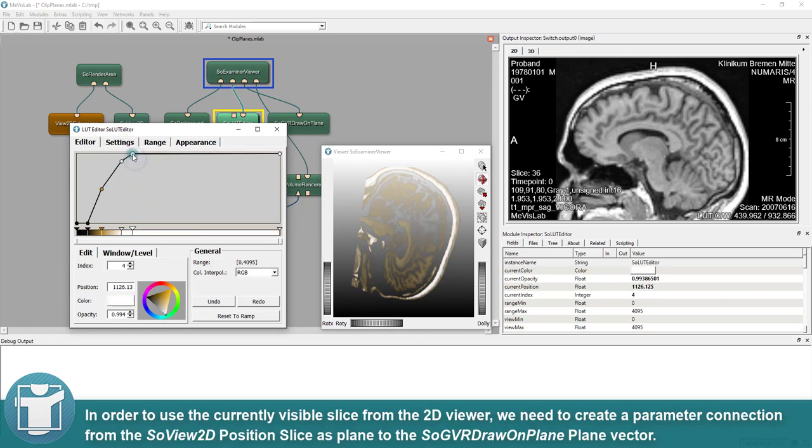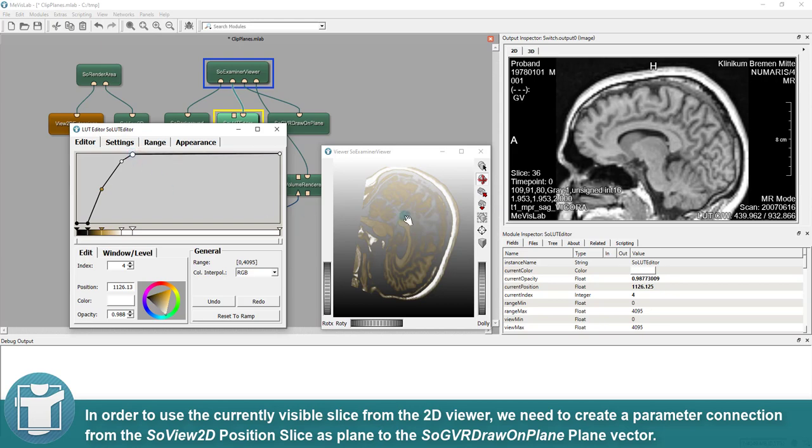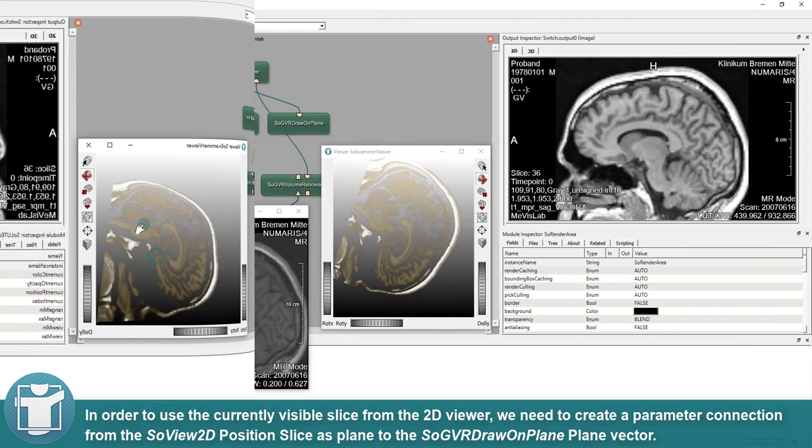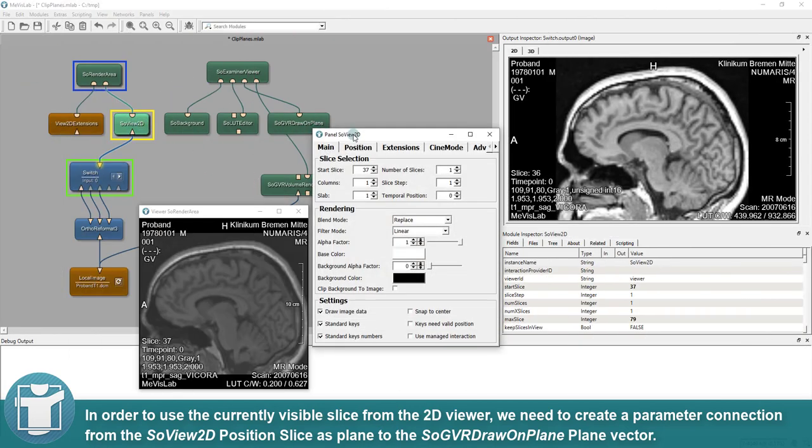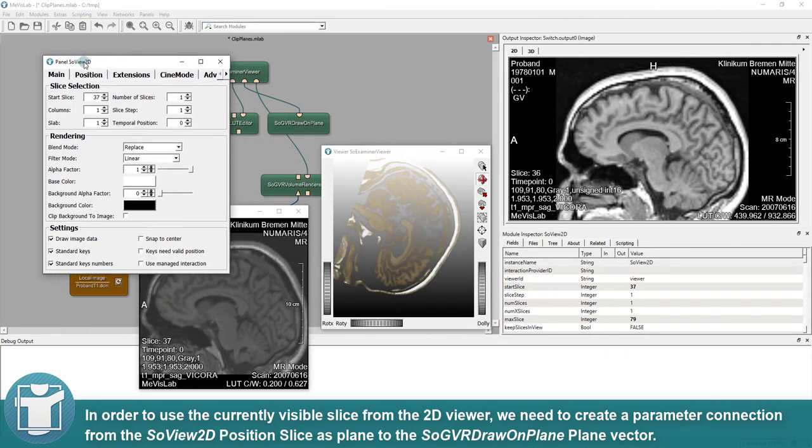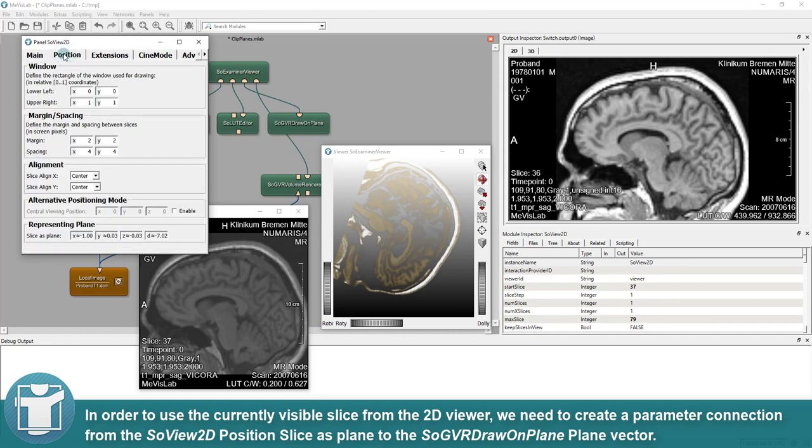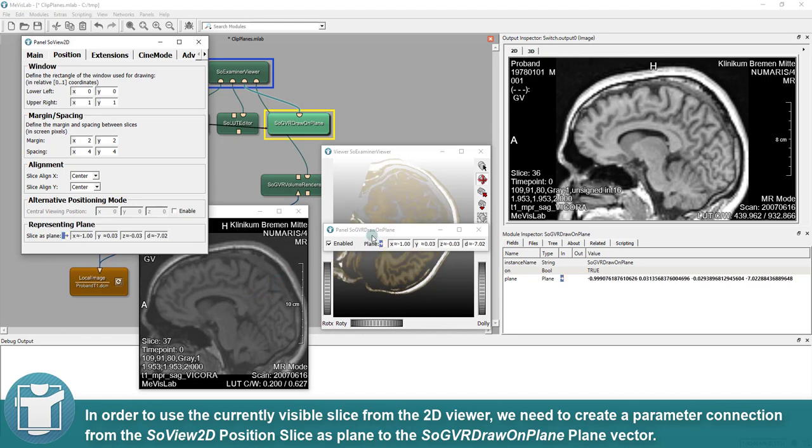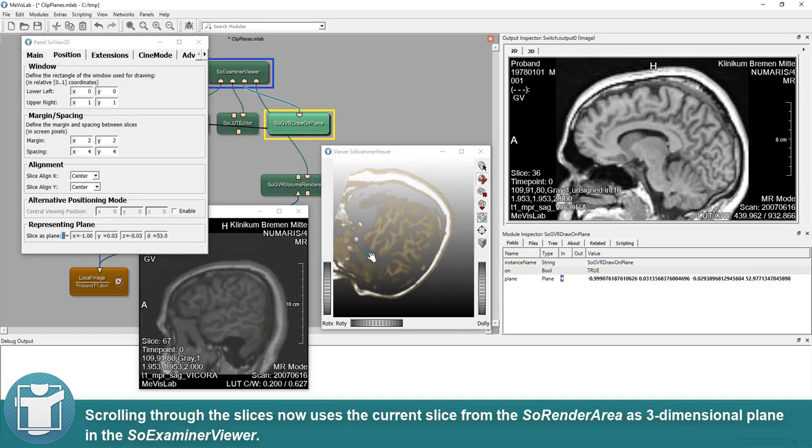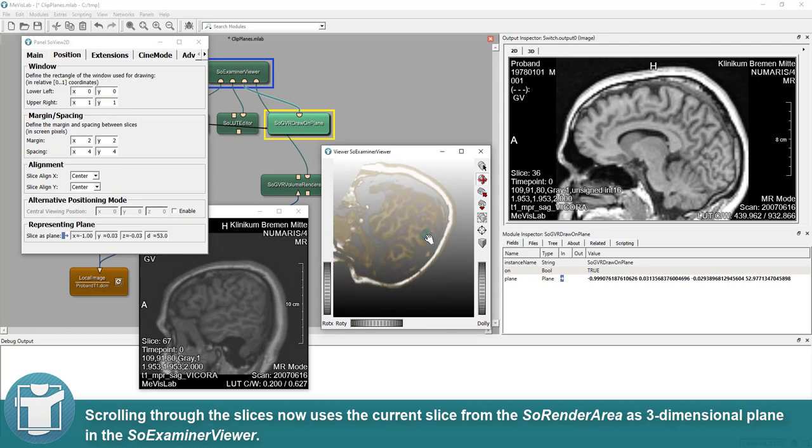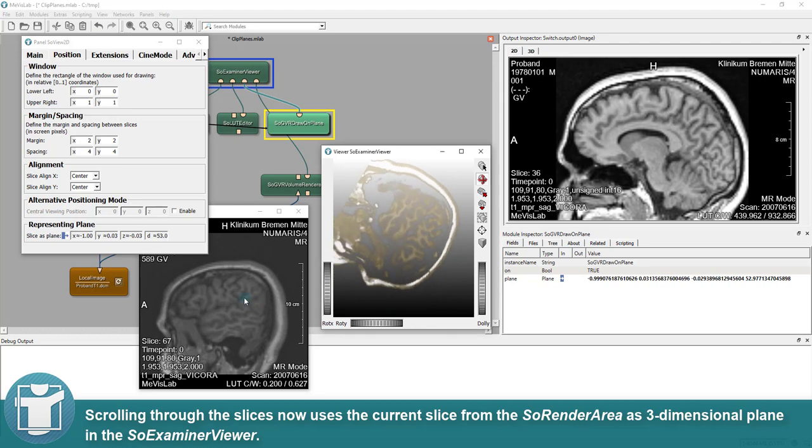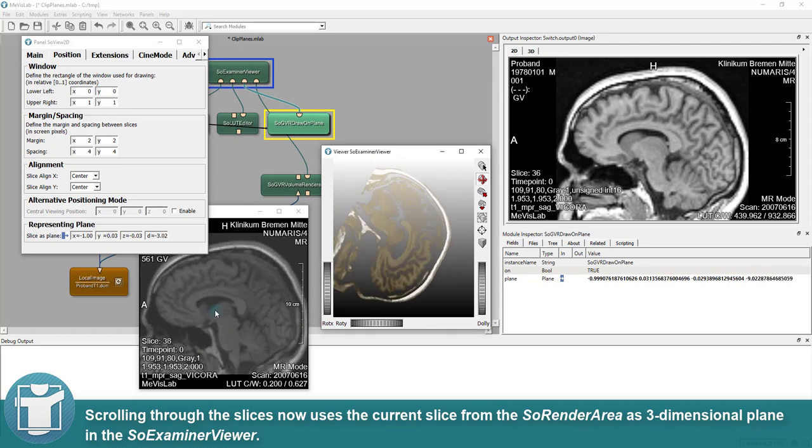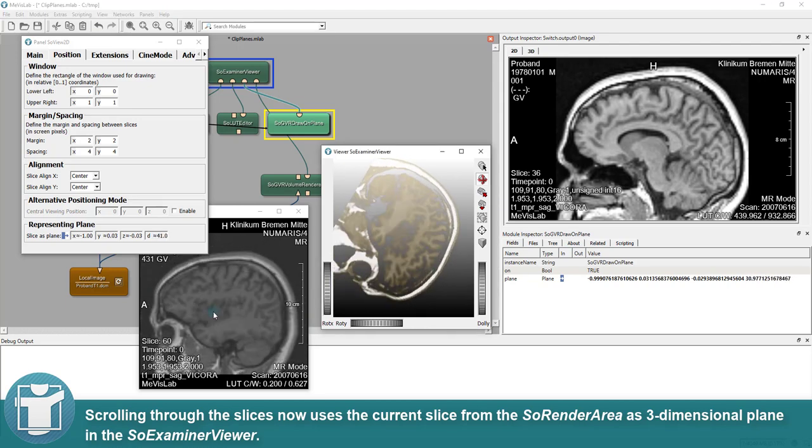In order to use the currently visible slice from the 2D viewer, we need to create a parameter connection from the SO View 2D Position Slice as Plane to the SO GVR Draw On Plane Vector. Scrolling through the slices now uses the current slice from the SO Render Area as a three-dimensional plane in the SO Examiner Viewer.